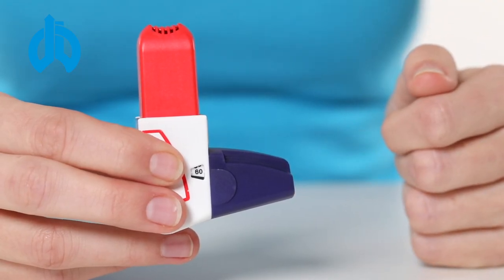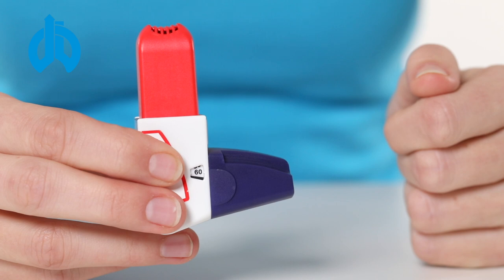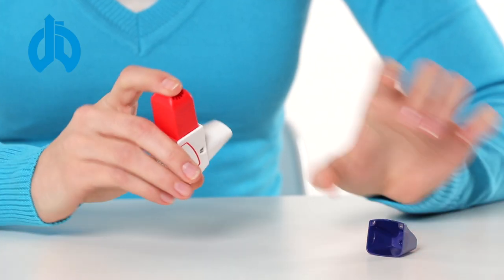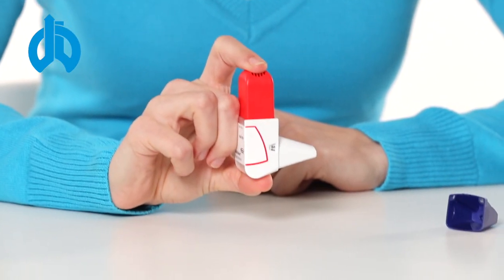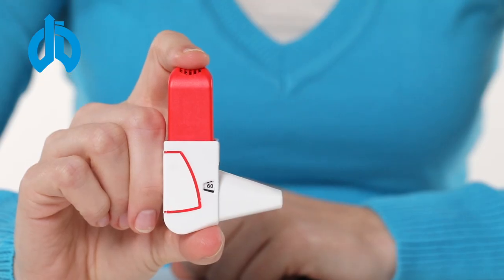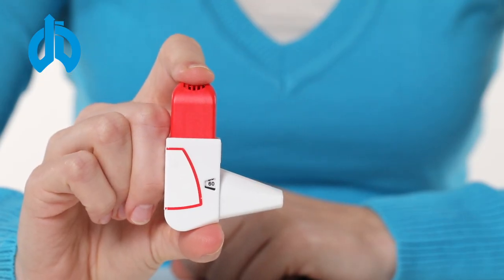Remove the protective cap from the mouthpiece. Shake the inhaler three to five times in a vertical position. Press the inhaler firmly between your thumb and forefinger until you hear a clicking sound, then let the device slide back to its initial position.